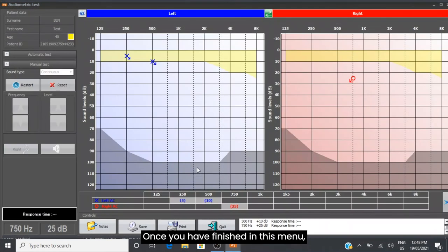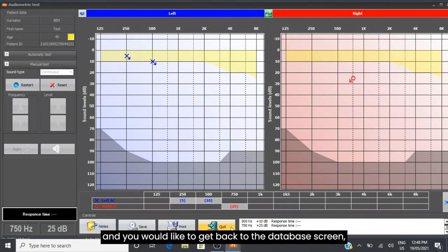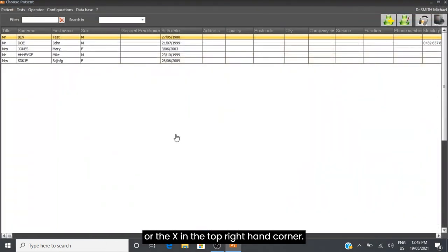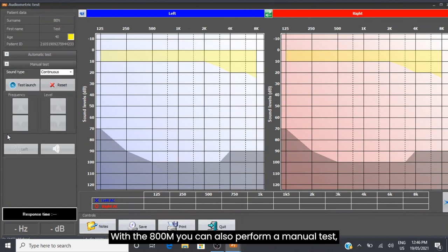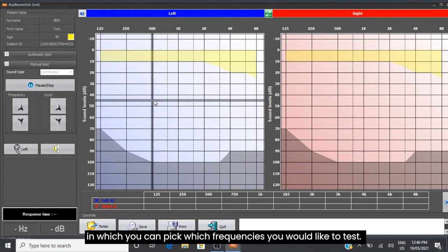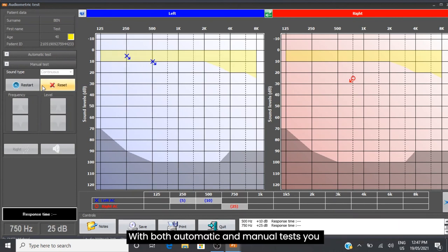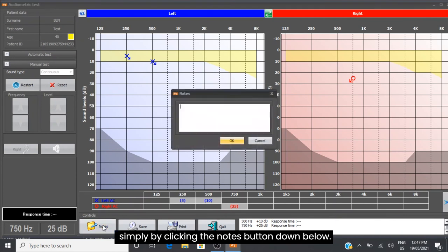Once you have finished in this menu and would like to get back to the database screen, you can hit the Quit button located at the bottom or the X in the top right corner. With the 800M, you can also perform a manual test where you can pick which frequencies you would like to test. With both automatic and manual tests, you can add notes about the patient by clicking the Notes button down below.